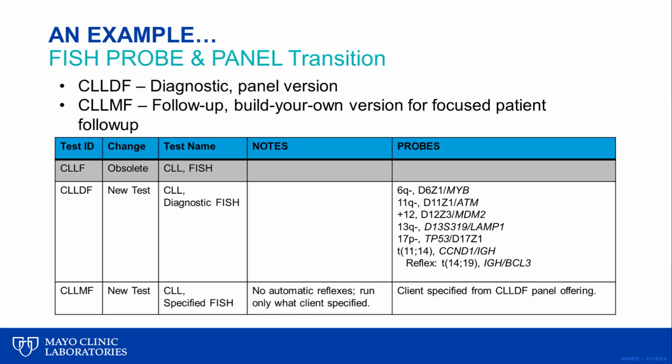Now I'd like to move on and show some specific examples of our FISH panels and how they have changed. We have already transitioned to this updated testing format for our CLL FISH testing, which went live in March of 2021. Using this as an example, the previous test ID, CLLF, was obsolete. This is the grayed out row shown here. We replaced CLLF with CLLDF, the D standing for diagnostic, and CLLMF, the M standing for miscellaneous, or requiring the order to specify when ordering which probe should be run.